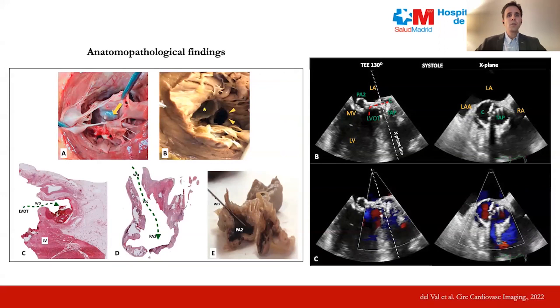And this finding had a good correlation with the echocardiographic results that showed a wall rupture in the LVOT in the lower edge of the TAVI prosthesis, and a tunnel-shaped structure connecting the LVOT and the anterior mitral leaflet, leading to a pseudoaneurysm of A2.